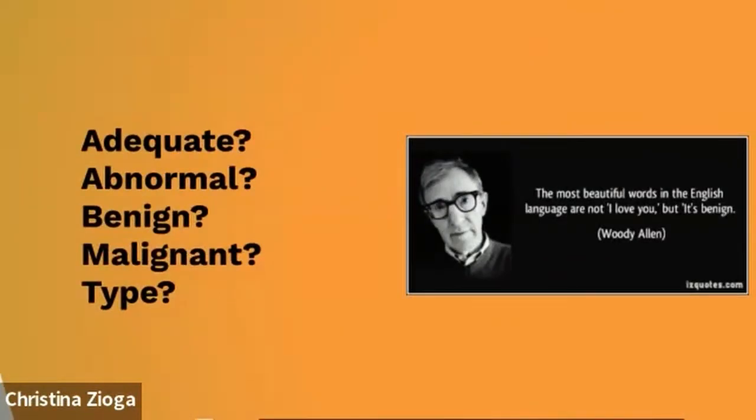Time is up. So, did your answers include expressions like adequate, abnormal, benign, malignant, type? Yes, right, Vandana, and Lina, and Lucas.